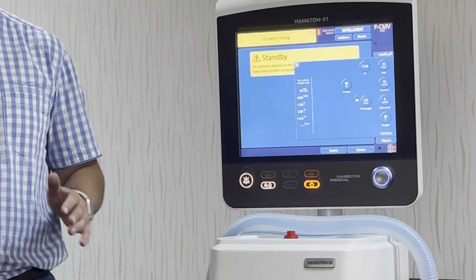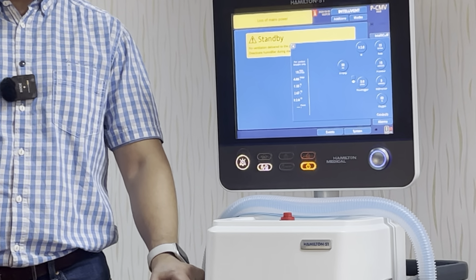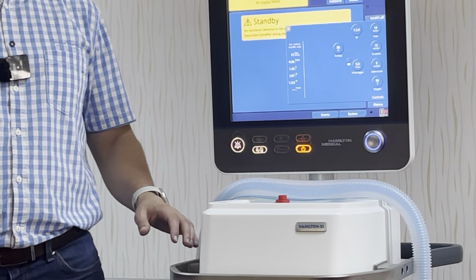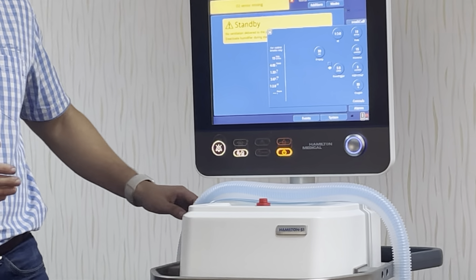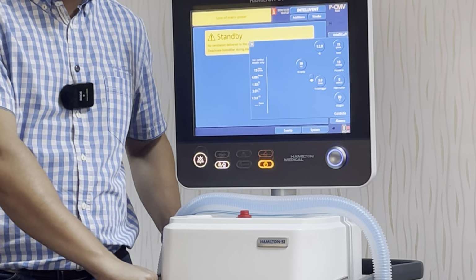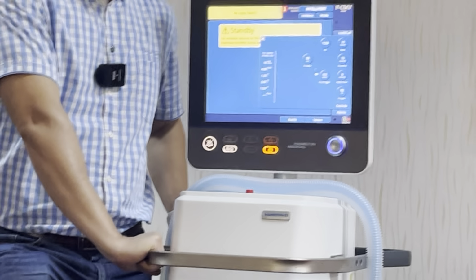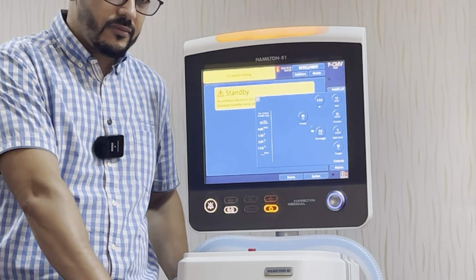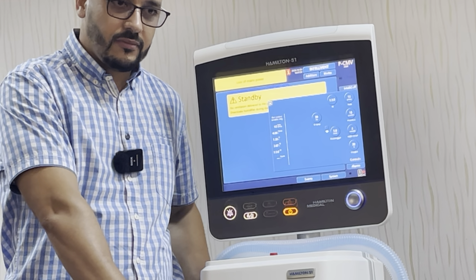They use the SIMV as a startup mode. So my question was, why are you using SIMV instead of CMV? What is the difference? There is a big debate between anesthesiologists and critical care medicine. Critical care medicine likes to use CMV. For us, synchronized intermittent mechanical ventilation, because the patient is breathing and this one is assisting them.